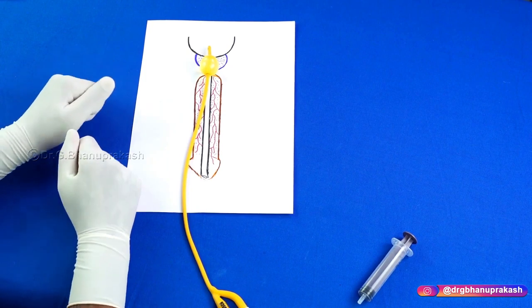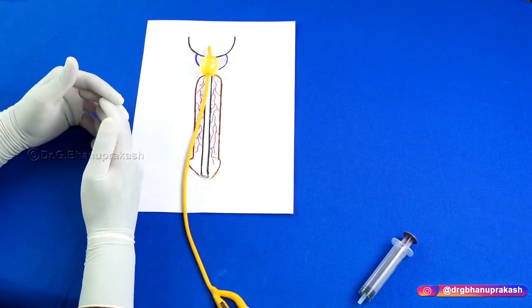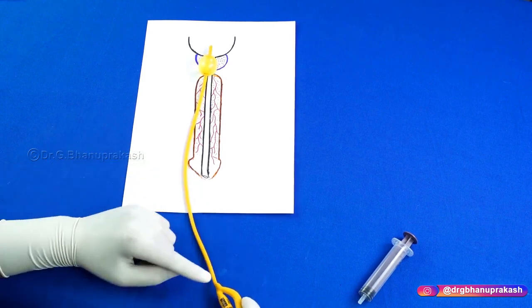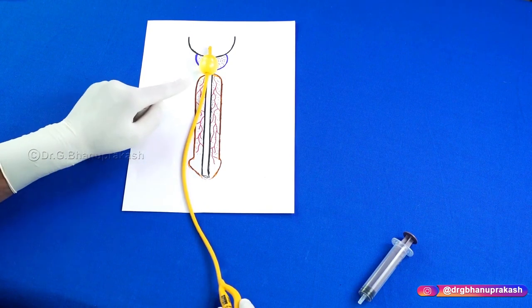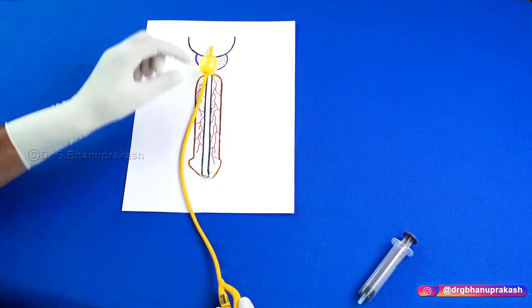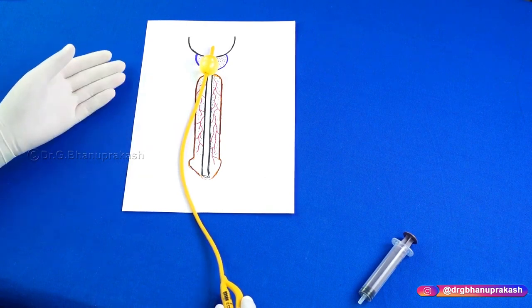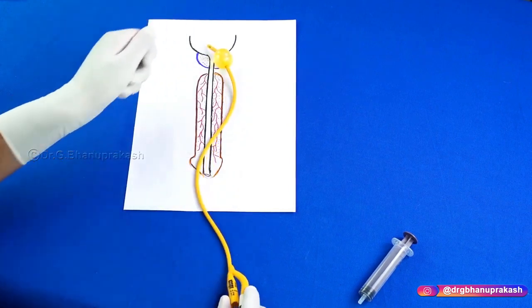Right. For example, there is an untrained nurse practitioner, and she tried to insert the Foley's catheter. Until she reached this Y junction, as she is inserting the Foley's catheter, in between itself, she has pushed 10 cc of distilled water and inflated the balloon in the membranous part of the urethra. So the membranous part of the urethra will rupture obviously. So when it ruptures, can I still insert the Foley's? Can I take out the Foley's and put a new Foley's and still insert it?